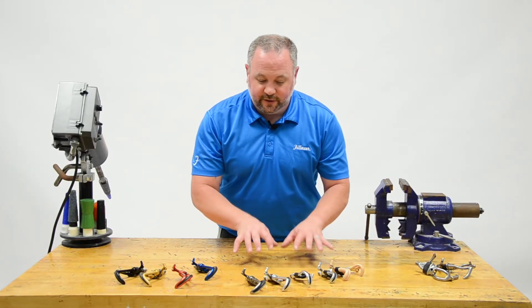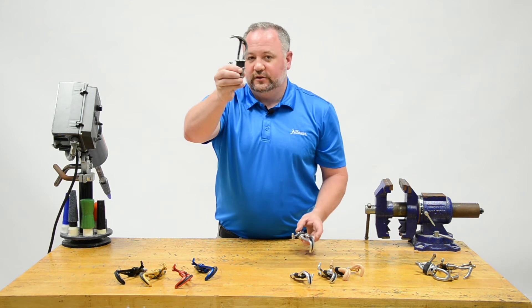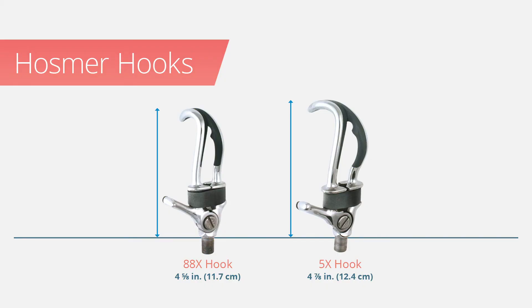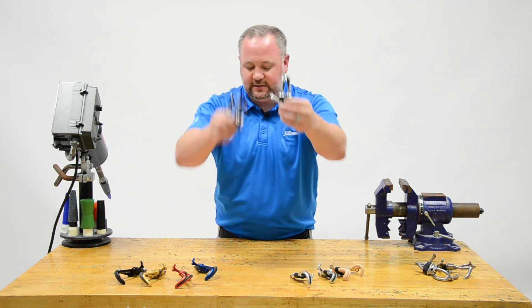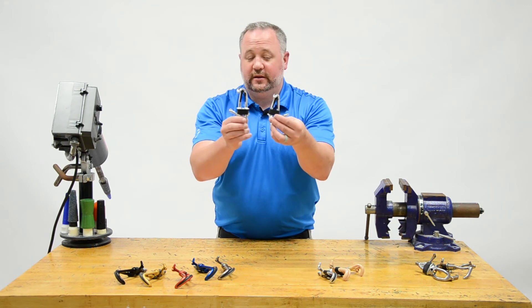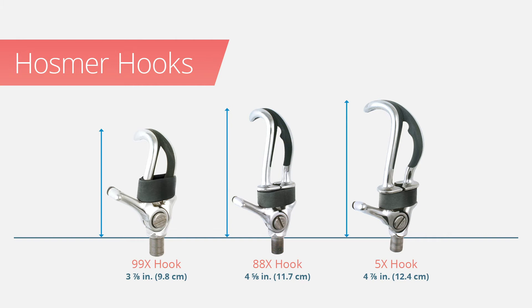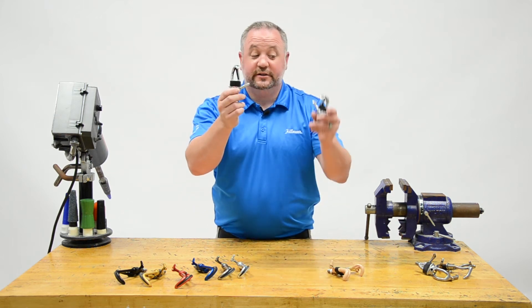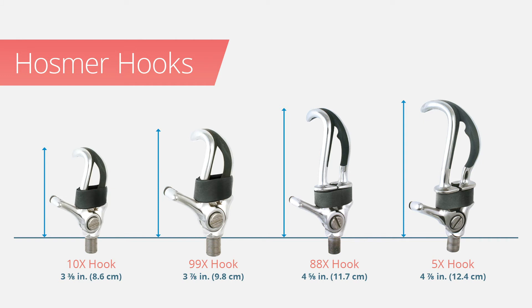These canted hooks also come in a lot of sizes. Taking a standard number five hook, I can drop down to the 88X, which is about a quarter inch shorter. For a medium-sized adult, smaller adult, or teenager, I may choose the 88X over the standard five. If that's still a little big, I can go down again to the 99X — the small adult hook — which is a little shorter still.